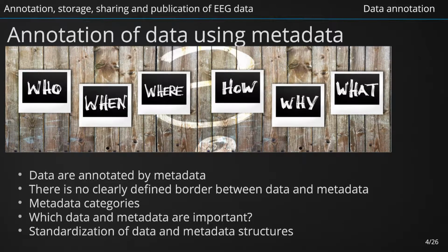There are several approaches to data annotation depending on related conceptual models and technical solutions. The conceptual view includes, for example, our need to separate metadata into some conceptual subcategories, or if we are just okay with a simple list of metadata items. Another example is if we want to use some standardized terminological terms, or we do not mind using our own naming of concepts. Of course, using any standardized approach can substantially increase the value of annotated data, and we will discuss data and metadata standardization initiatives later.